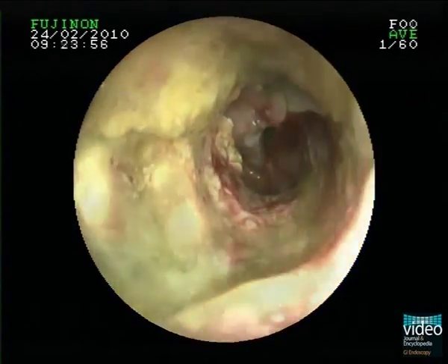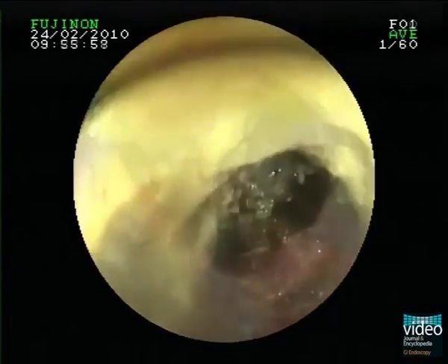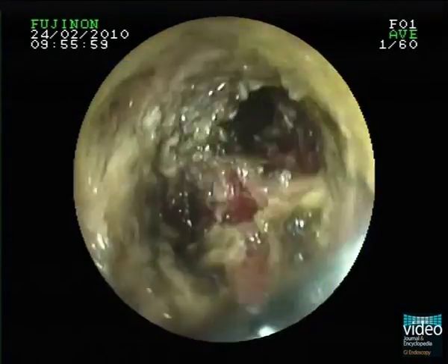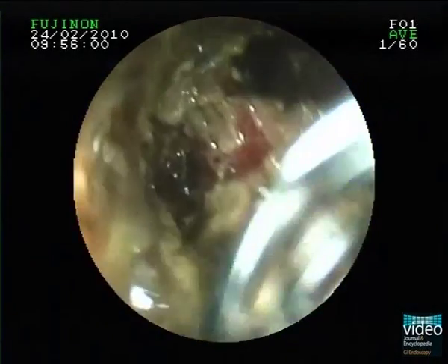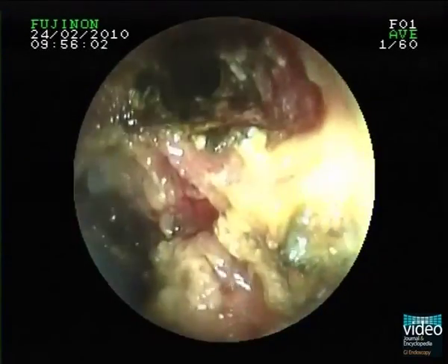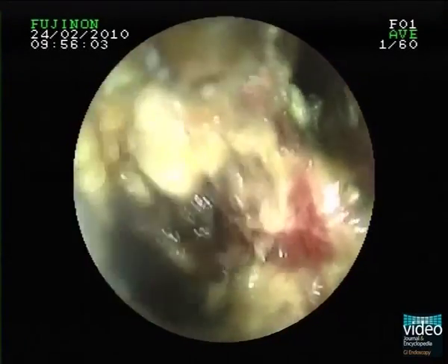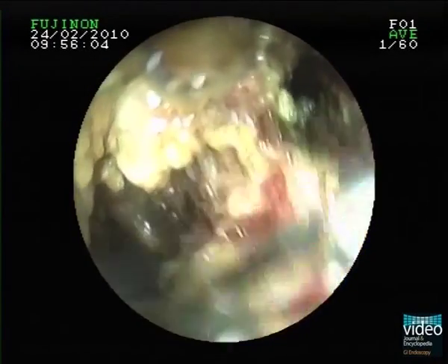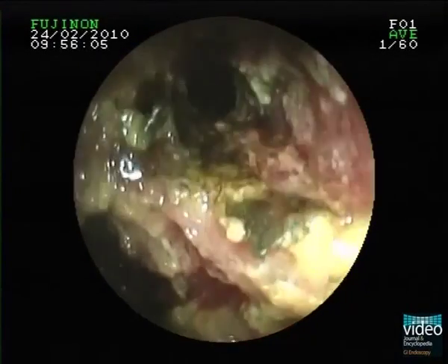This is already a nice result with subtotal ablation of the lesion. We successfully reopened both ducts for optimal drainage of the biliary tree.